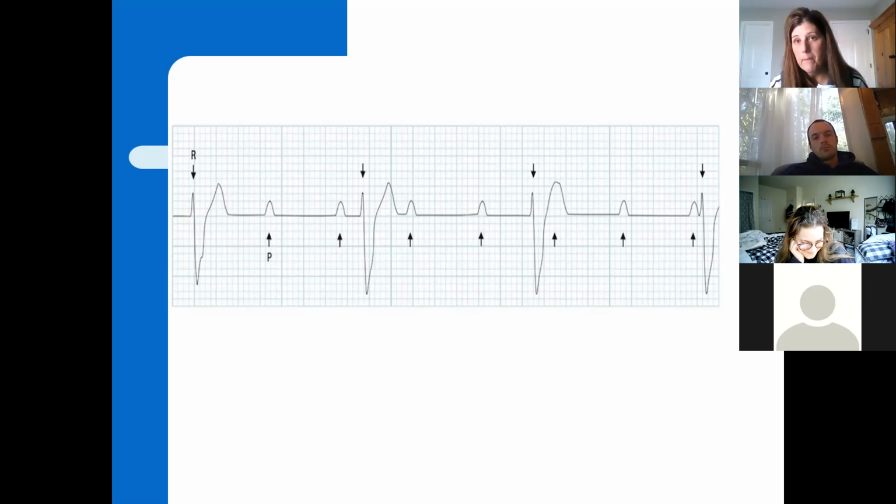Okay. For the test EKG strips, will they all look the same, or will they be kind of like how they have been in lecture, where they all kind of look different? Yeah, there can be a variety.